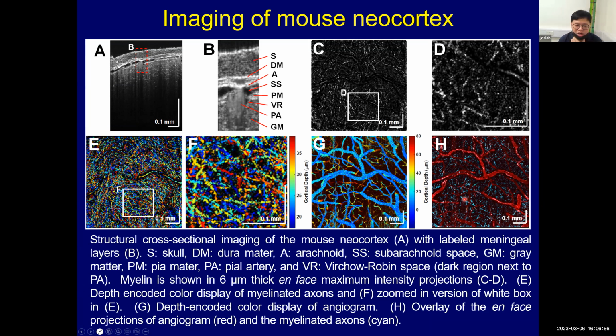in the cortex. But as you may also notice, if you use visible light OCT for this kind of application, your penetration depth is going to be very shallow. I'm talking probably 400 to 500 micron. But you can appreciate much higher resolution, as you can see that some of this structure may not be able to be seen in other wavelengths or in other lower resolution variants.